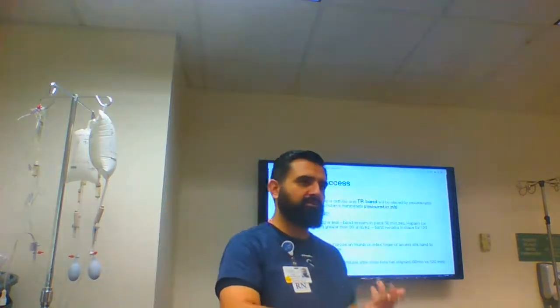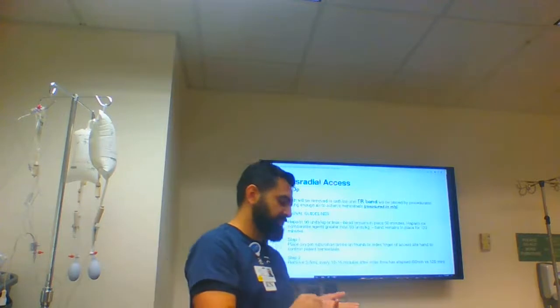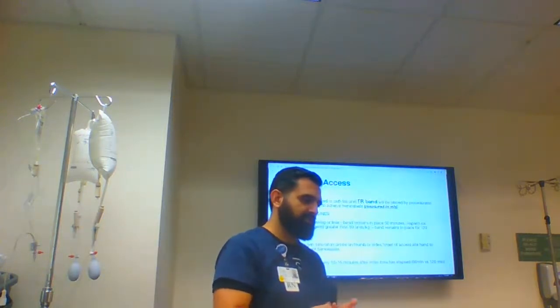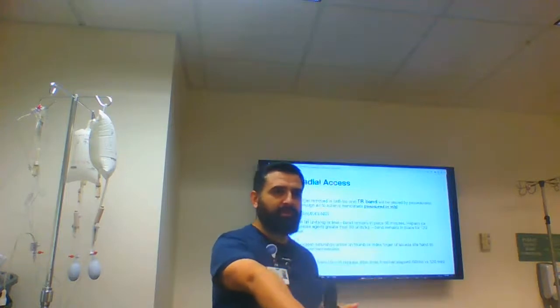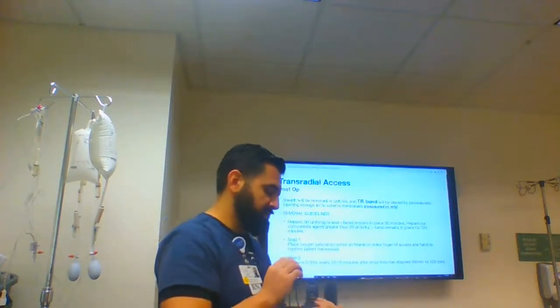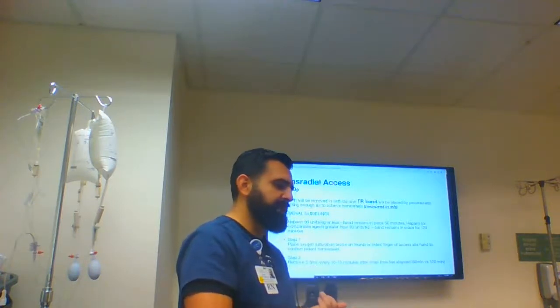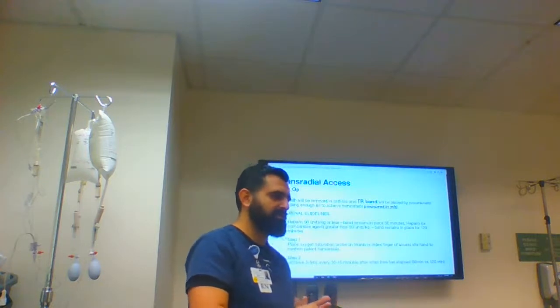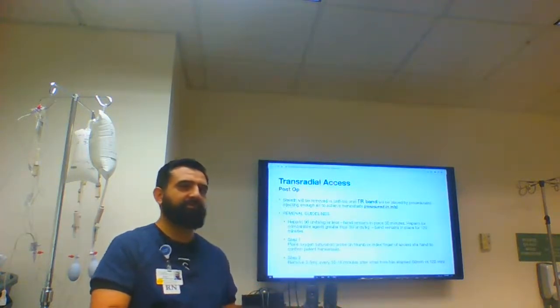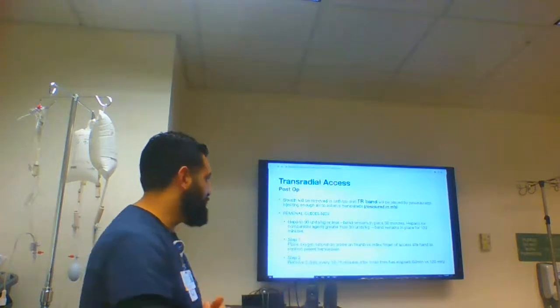It's like a little cocktail, verapamil, depending on who it is. Dr. Ricardo Jr. and Joaquin are the only ones that you'll probably see do radials. Joaquin will use like 5 of verapamil. Every now and then he'll use nitro, and Dr. Ricardo Jr. will use like 2.5 of verapamil and 200 mics of nitro. But they all use heparin.